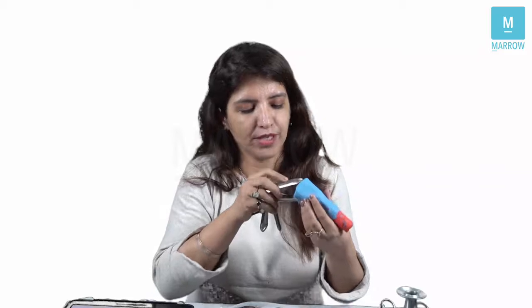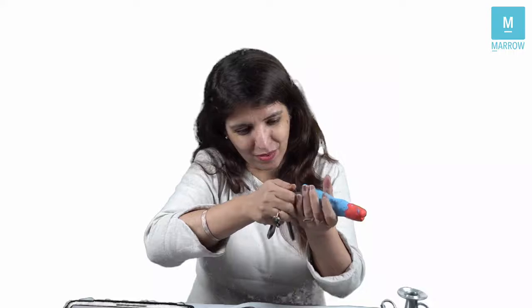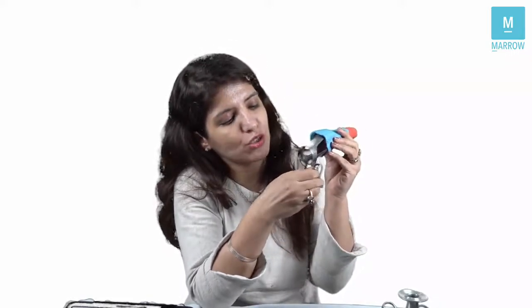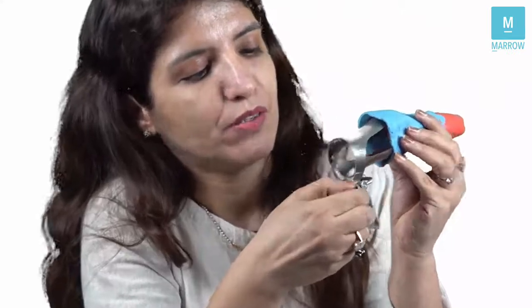Now Cusco's speculum has double blades. My Cusco's is a little old now, right? Now I am going to insert the Cusco's speculum and then I am going to tighten the screw over here, right? When I tighten the screw over here, the Cusco's is going to tighten and it is a self-retaining speculum. So my hands are now free for whatever procedure I need to do, right?